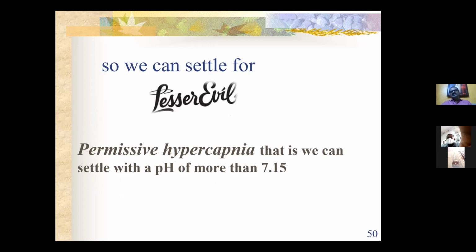6 to 8 ml. Even we can use 3 to 4 ml. That is acceptable now in an ARDS. In severe ARDS cases, we will be using 3 to 4 ml only. And what we are basically trying to achieve is the concept of permissive hypercapnia. We don't want to keep high tidal volumes for the patient.